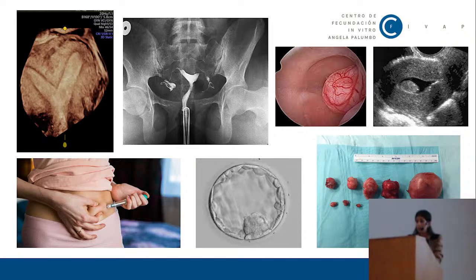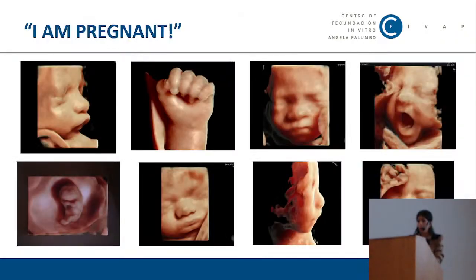And finally, this is happening. And from this moment, the only thing that they want is this. They come to me with all their history behind, and now all they expect is this kind of scans. They ask for their scans in 3D, 4D, 5D, or all the Ds. And to be honest, I enjoy so much being part of good news.